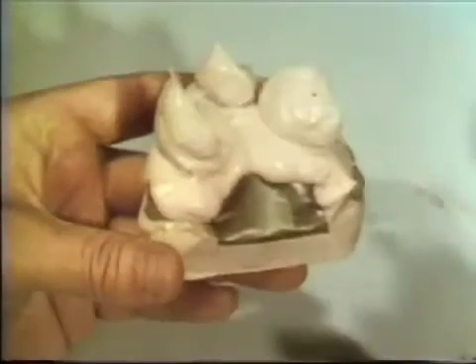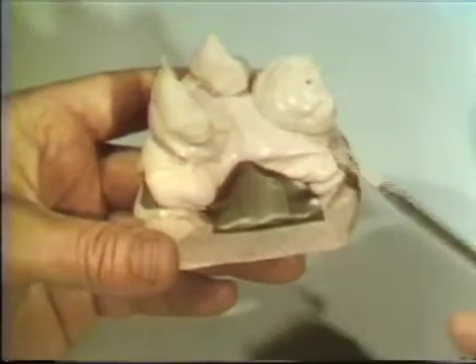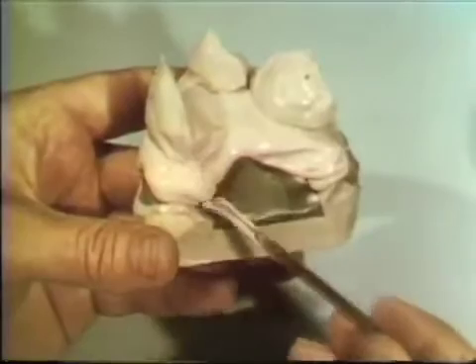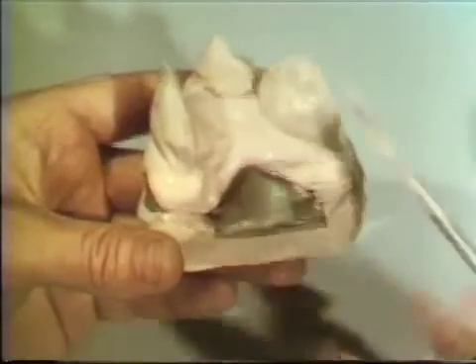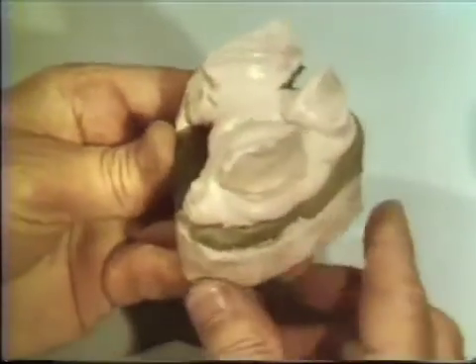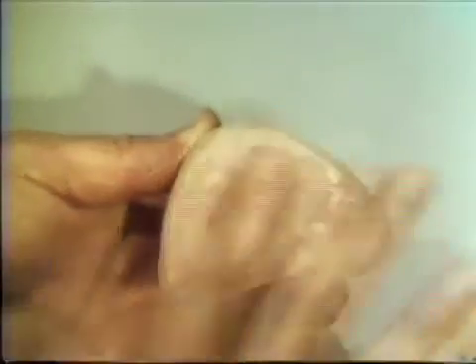This template is allowed to set and is not removed from the curing cast until the articulator mounting has been completed. The knobs of stone on the template help to secure it to the articulator. After the stone has set, the base of the curing cast is lubricated so that it can readily be removed from the mounting later in the procedure.